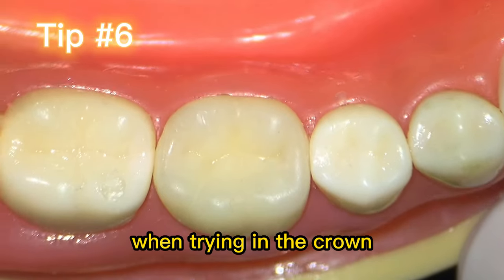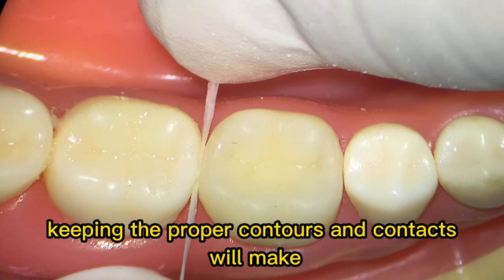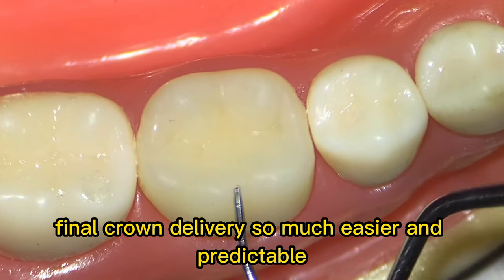Tip number six: when trying in the crown, look for proper contacts, contours, and margins. Keeping the proper contours and contacts will make final crown delivery so much easier and predictable.